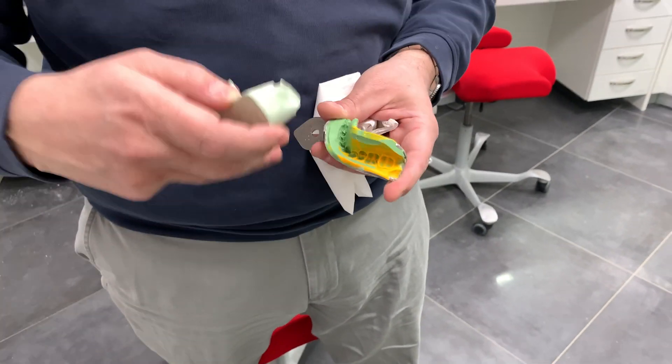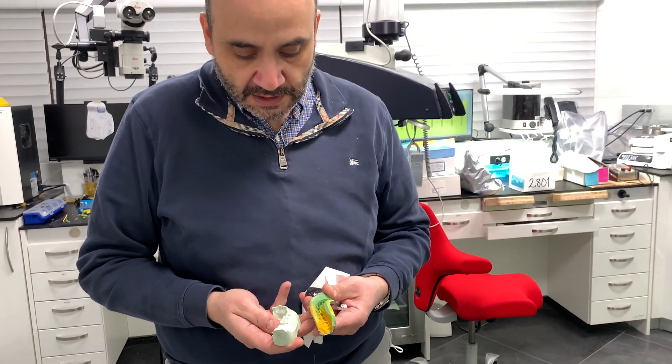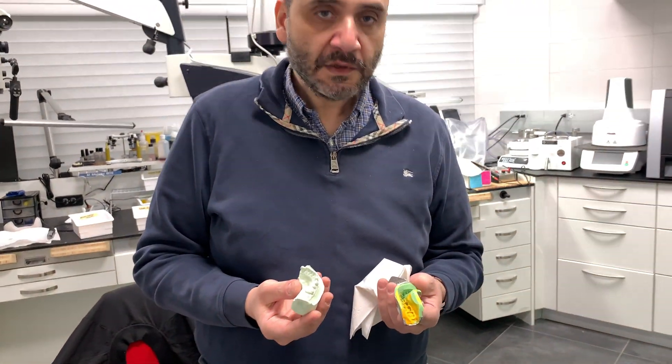You can use it for a full arch as well — maxillary, mandibular — and I also use it for my complete denture cases. All right, thanks!